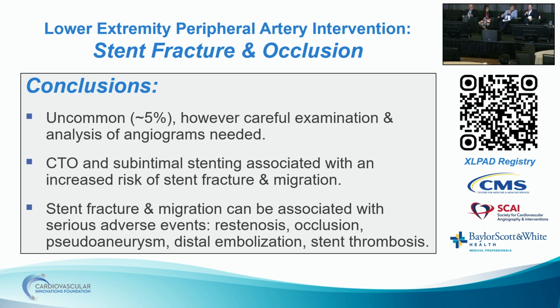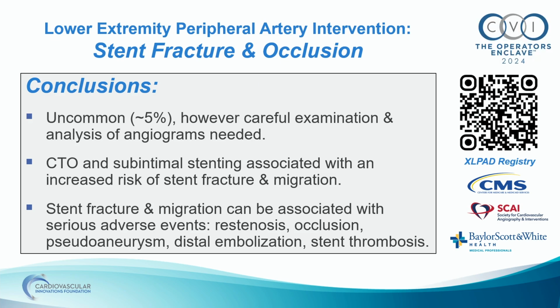So Subhash, I gotta bring up that perhaps many moons ago in a galaxy far, far away, we actually did this study in normal patients with SFA. We actually put wires down and looked at and published this in CCI Medical Physics. The amount of foreshortening that occurs, and we all see that. We put quantitative analysis onto it. I think we underestimate how much the SFA not only moves, compresses, and has translational torque force. And I'll reference you to that paper from CCI from 2009, I think.